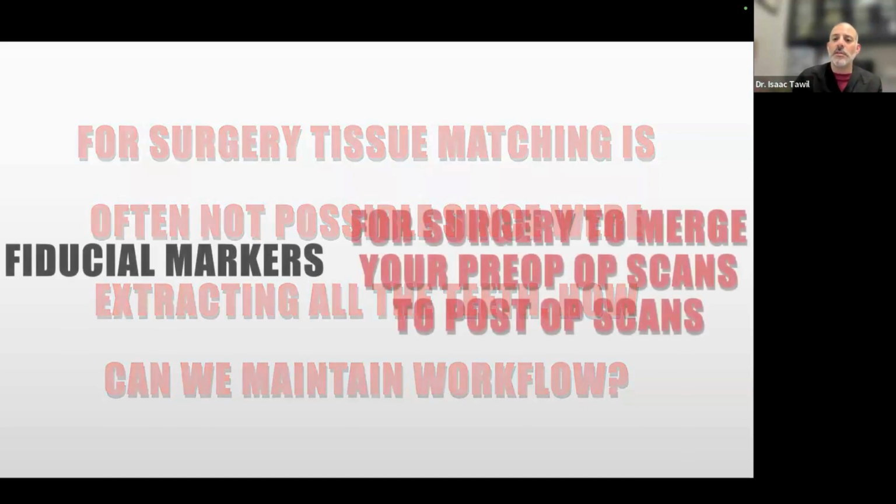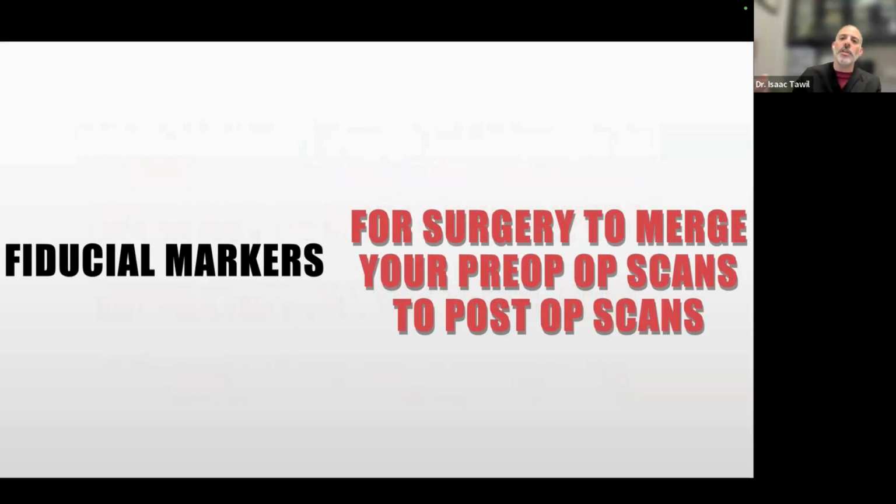The answer is we need to use fiducial markers. You can do a pre-op CBCT and a post-op CBCT and match them together. I've had many patients faint on me standing up taking a post-op CBCT, so I'm not really interested in taking a post-op CBCT, but that is one method. Could you use a denture and do a realignment with healing caps? Yes, but to me, that's not fully digital. I want to be fully digital. And so how do we go around this?